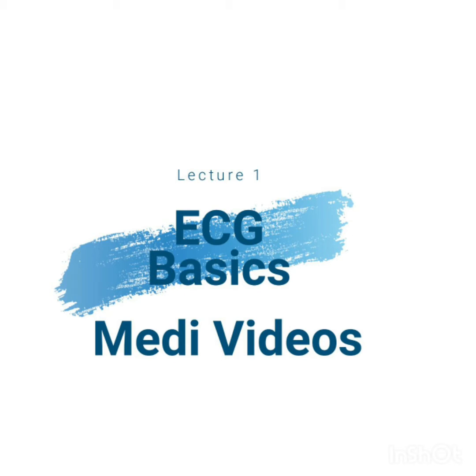Uzma Khan from team Medi videos, and today we are starting with our first lecture series that's about ECG. So today is the first lecture about ECG. In these ECG videos I am going to discuss the ECG paper, the waves on ECG, various intervals and their significance of course, and then what are the abnormalities that are being seen in the ECG. So this is the prime target.